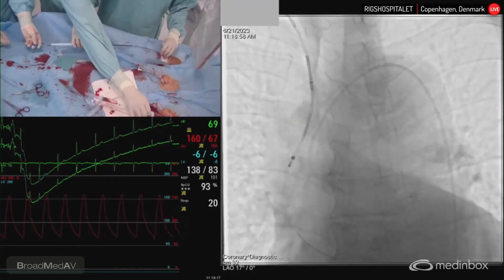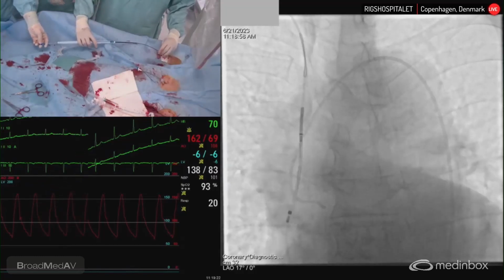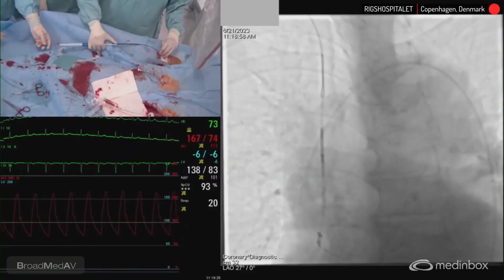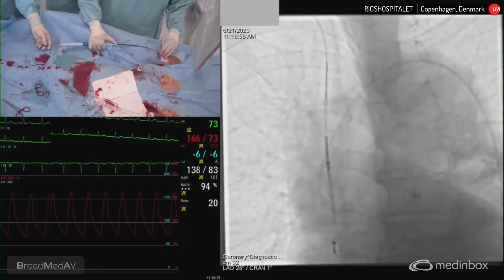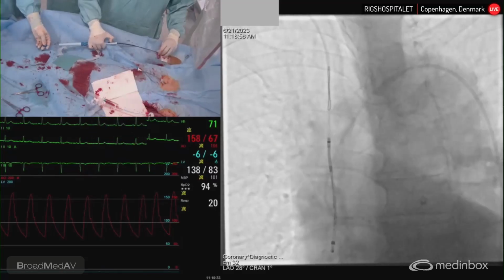Maybe because I saw it on the CT, these vessels are pretty much close to the valve. They're not really on top of the arch. I'll open up the arch more even. I think this maybe a tiny bit lower, and then you're almost in a good position to deploy the first filter. Okay, you can go ahead.